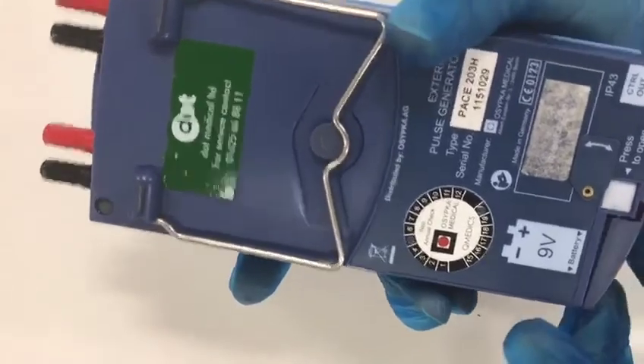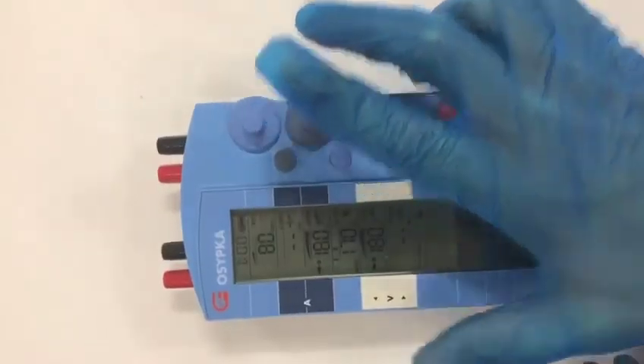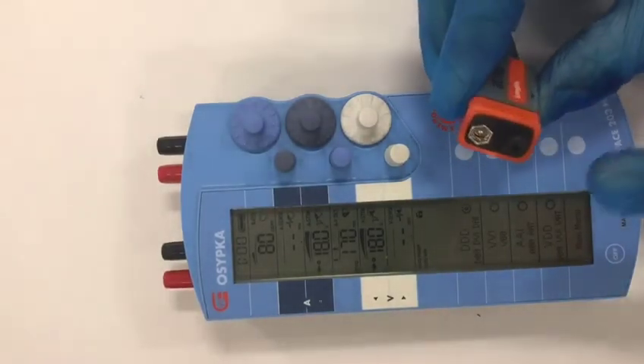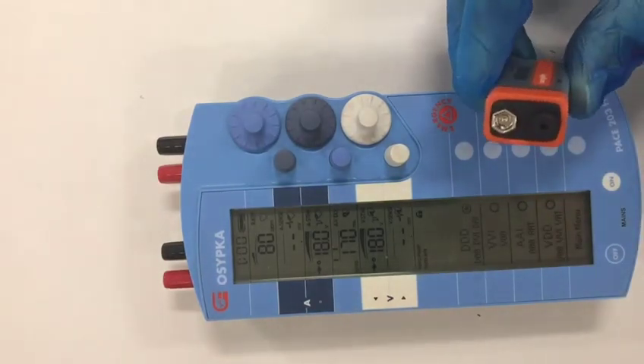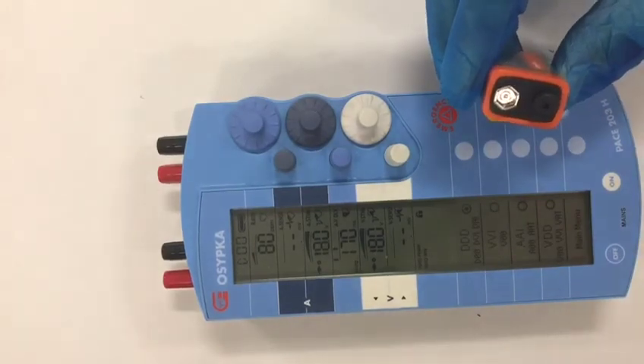Pop the battery in, close it, close the flap — there are no more buttons to press. It will carry on without a pause exactly as you left it. Be aware that some batteries have a little plastic cap on them that needs to be removed before you insert the battery. Some batteries also have cellophane wrapped around them and that cellophane has to be removed too.